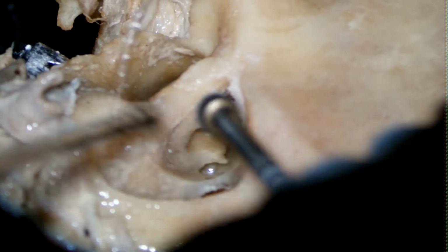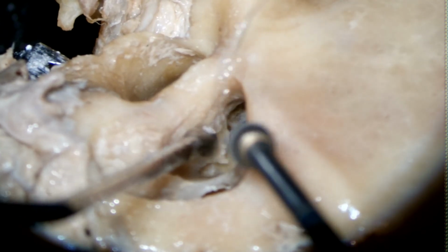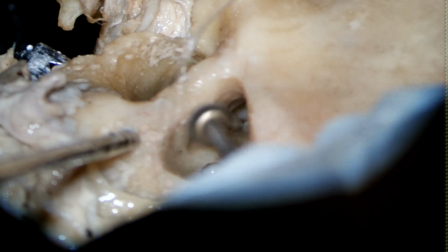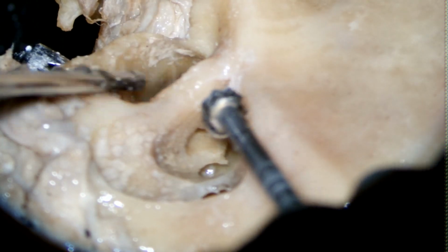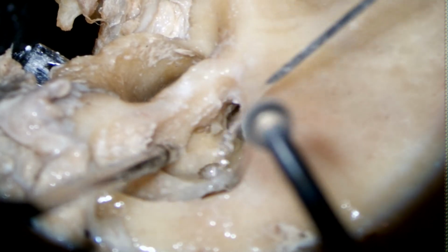So can anybody tell me the landmarks for posterior tympanotomy? Yes, anybody who can tell me landmarks of posterior tympanotomy? Okay, what is facial recess? Boundaries of facial recess.